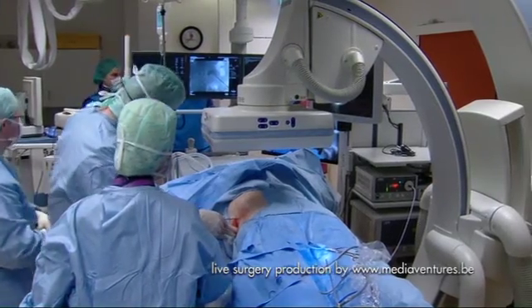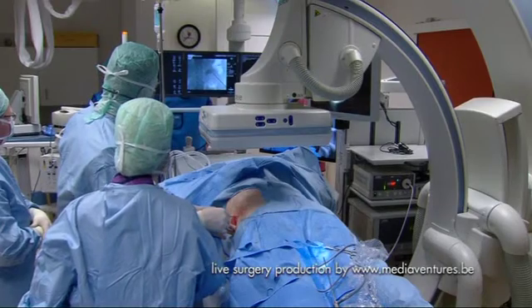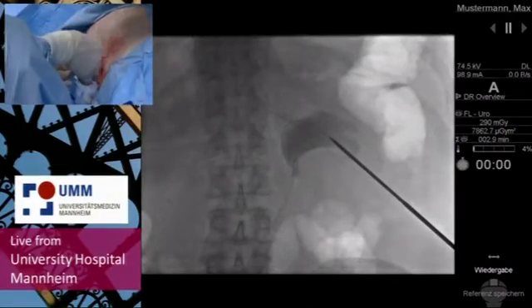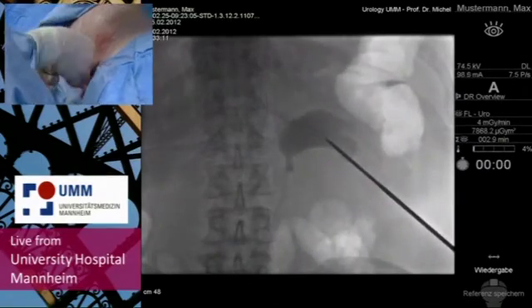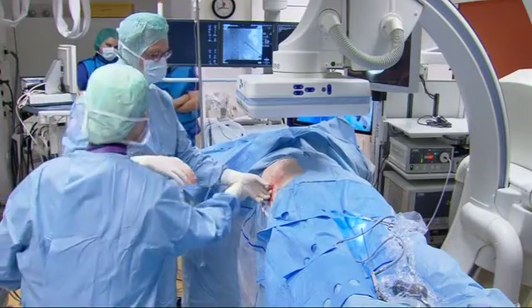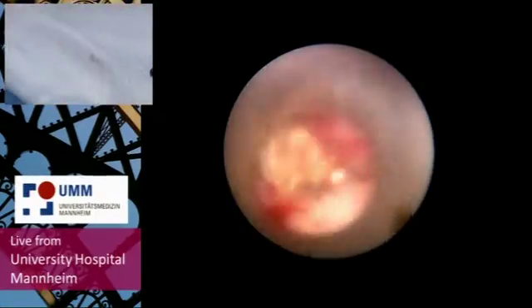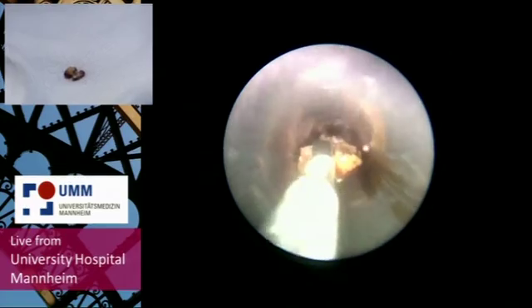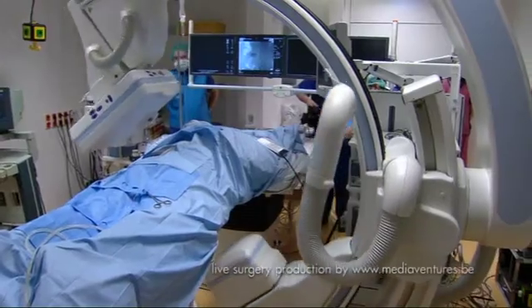In a surgery video broadcast live to Paris, the Mannheim urologists are presenting the new CT device to their international medical colleagues. The imaging assists the physician even before the intervention, for example when feeding the tube into the kidney. The 64-year-old patient here has a kidney stone one centimeter in size, to be removed with minimally invasive surgery — a so-called mini-PCNL — through the back. After puncturing the renal calyx, the stone is fragmented and removed via the working channel.